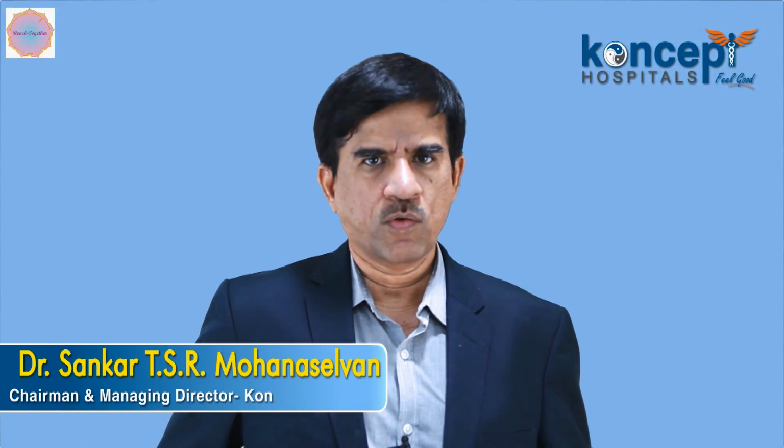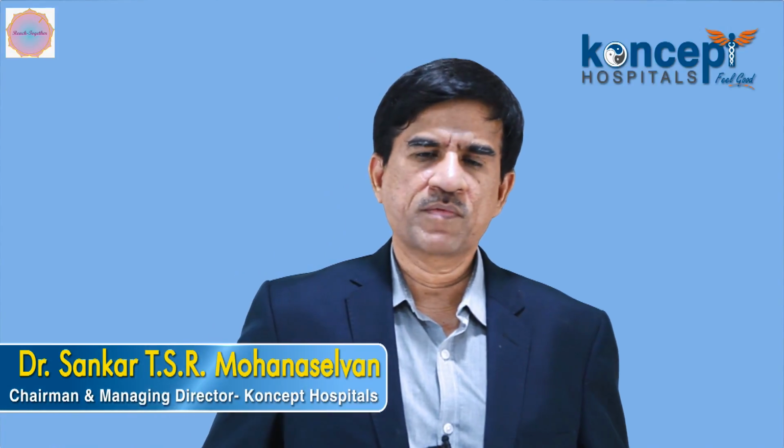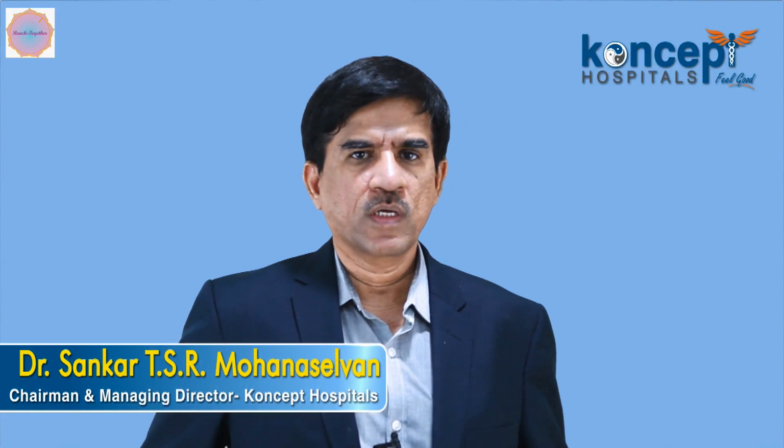Koncept Hospital has a very novel way of diagnosis also. Apart from the conventional blood diagnostic procedures, we do what is called live blood analysis and dry blood analysis. Live blood analysis is nothing but taking your blood by a prick and mounting it under the microscope and seeing the cells live, whereas in normal conventional methods we put dye into the tissues or the blood and kill the cells and only see the dead cells.